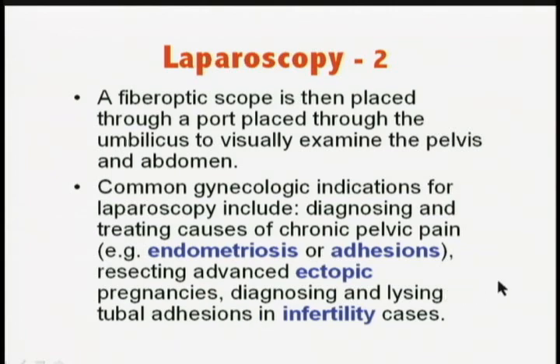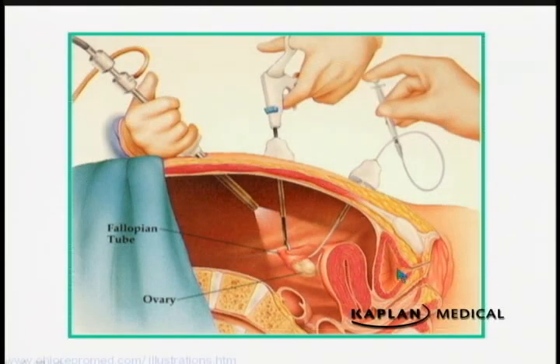And here you can see the scope, which illuminates. You can see how the abdominal wall is extended away from the viscera, and then you can use various ports to do your procedures.